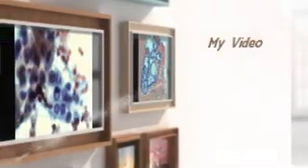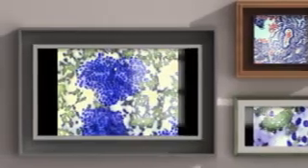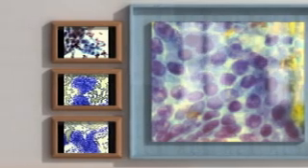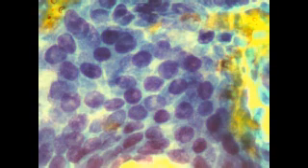I'm presenting a case of a papillary thyroid carcinoma. This is a case for papillary thyroid carcinoma, which is considered to be the most common cancer of the thyroid gland. This case belonged to a female patient in her 40s, presenting with a right neck nodule.